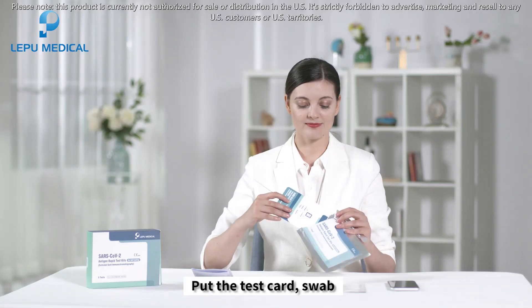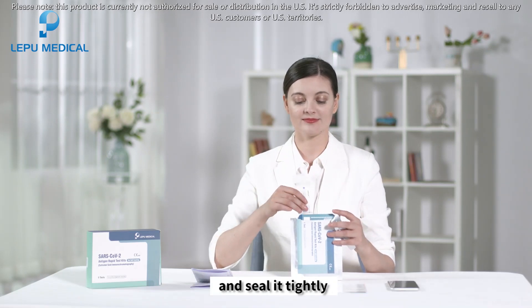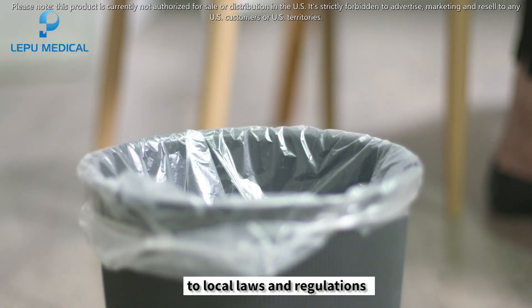After the test, put the test card, swab, and sample treatment solution bottle back into the outer package and seal it tightly. Dispose of the bag in a medical waste container according to local laws and regulations.